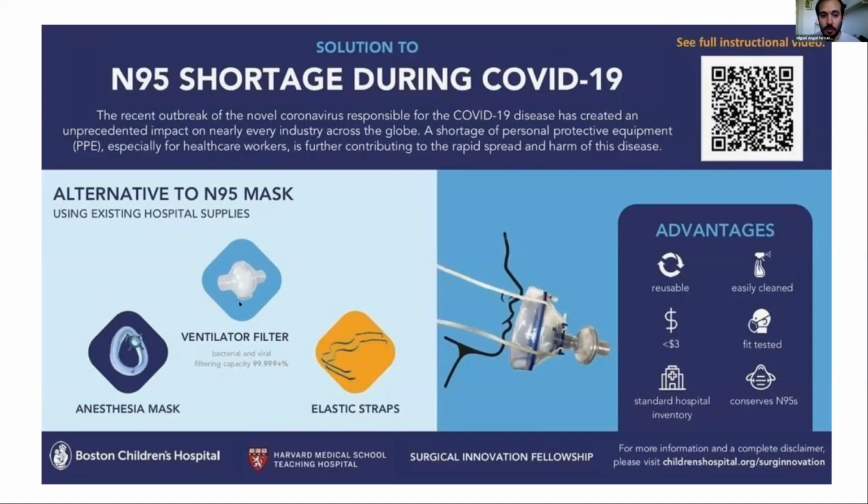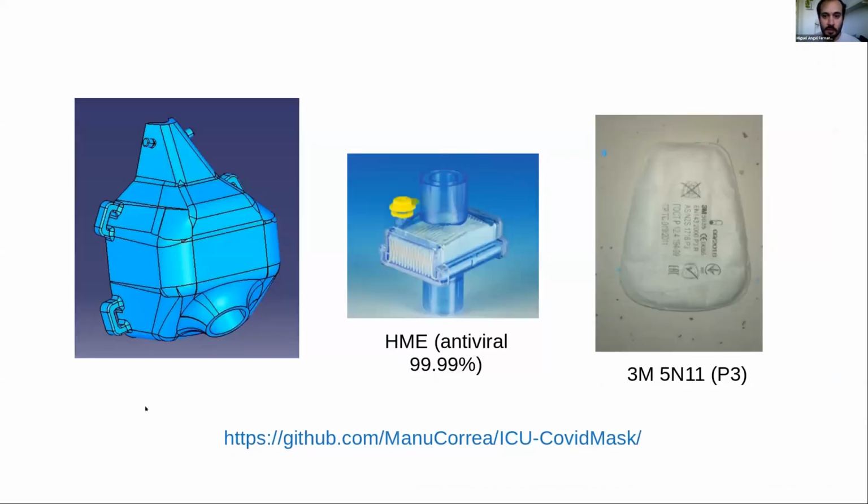Then we wanted to give a solution that can be used instead of the anesthesia mask from the community. So for this, we developed with a team, of course involving physicians and designers, and we came up with this one. It looks very ugly, but everything there has a function. What you can see is that with this one, you can already put one of these HME antiviral filters, the kind of filters that I was just explaining in the last slide.